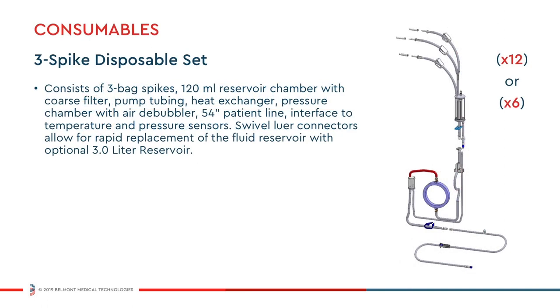The Belmont 3-Spike Disposable Set contains everything you need for a procedure and is the only consumable required to operate the Rapid Infuser at its full range of flow rates. The Disposable Set consists of three bag spikes, a heat exchanger, a 54-inch patient line, and a 120-milliliter coarse blood filter reservoir. Quick connections below the reservoir allow for easy and rapid replacement with the optional 3-liter reservoir.